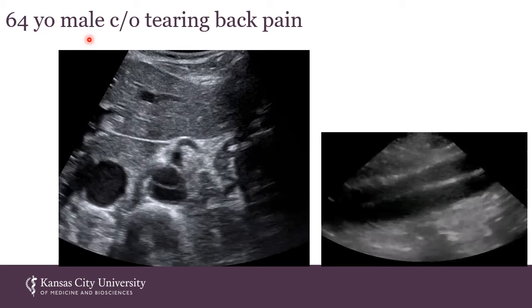And so I put the ultrasound on him, and here's his aorta, and look at this line right here, okay? That is not normal, okay? And so then in longitudinal view, here's what we've got. And so this man had an aortic dissection, and so you can imagine the conversation I had with the attending cardiologist at 3 in the morning. He's like, well, how do you know he's got an aortic dissection? I'm like, because I'm sitting here looking at it on the ultrasound machine.